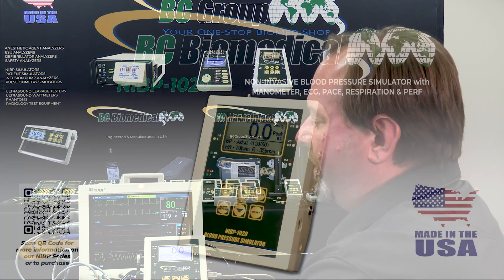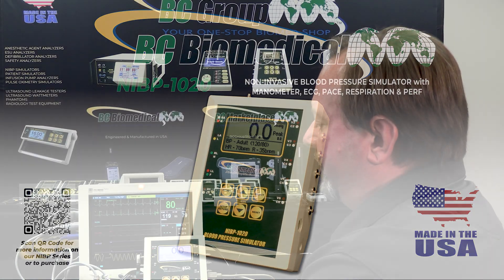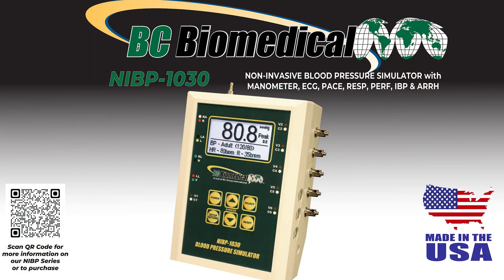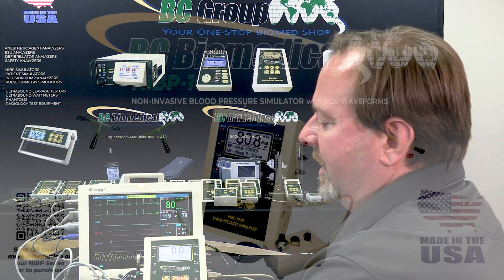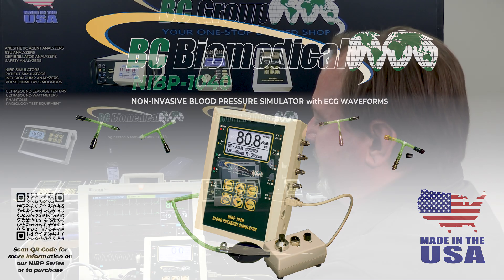The 1020 series adds ECG. The 1030 series adds temperature and invasive blood pressure simulation. The 1040 adds cardiac output and fetal maternal simulation.